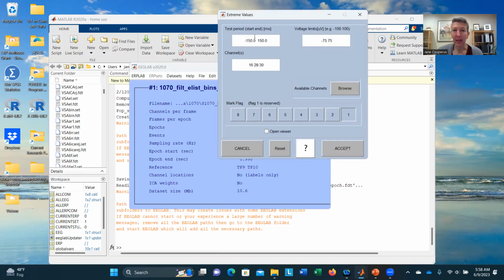So when we do that, we need to set our time window. So for this one, I'm just going to be interested in, say, the period of time when the stimulus was on the screen. I could do that -200 to 200. In this case, I did -150 to 150. Whatever you decide, you can change those numbers to say, this is the window I care about. I could have cared about the entire window. I could have cared about all the way through 800, if that's my epoch window. You then need to set voltage limits. So you might say -100 to 100 or -75 to 75, but you want to decide what those are. I'm going to go back to -75 to 75.